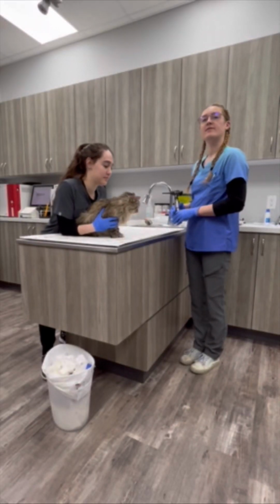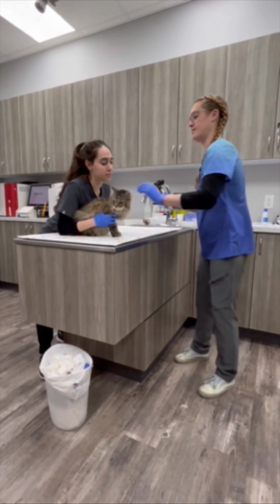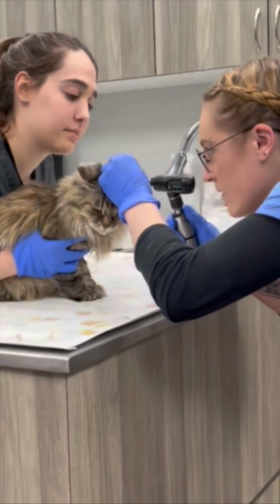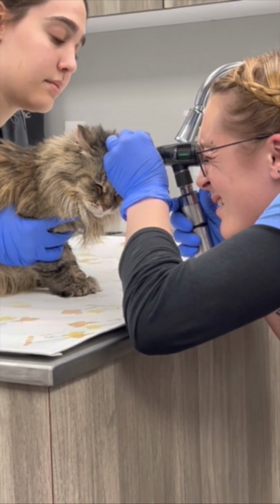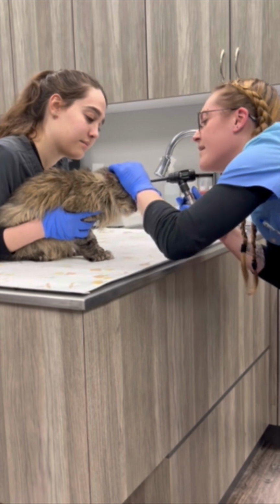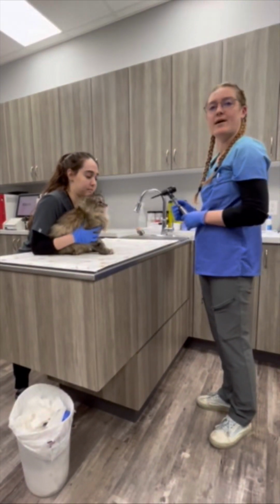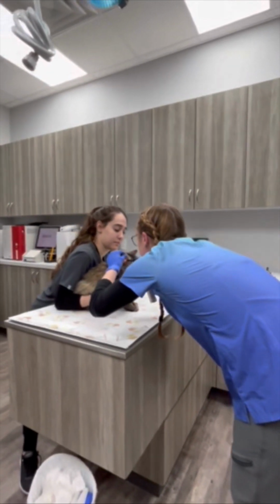I am now using an otoscope to visualize the tympanic membrane of Pup's ears. I will be starting with her left ear. The tympanic membrane is a light pink color. I have full visualization of the tympanic membrane, and there is no fluid buildup, discharge, or any other abnormalities noted in her left ear. I'll be repeating this step on the right ear.